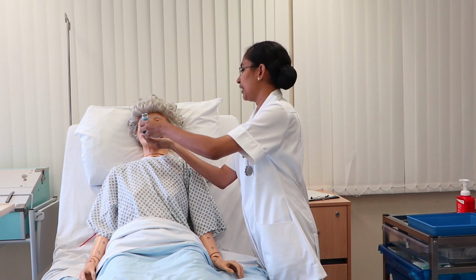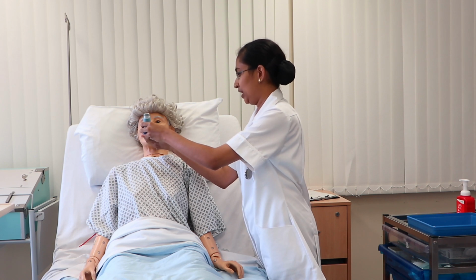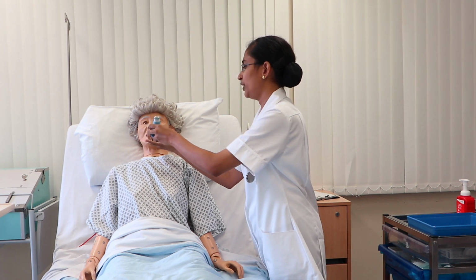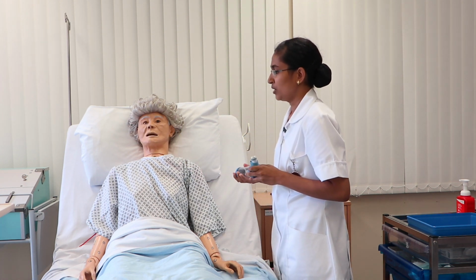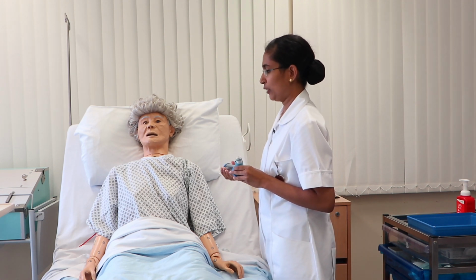Okay, can we have 5 cycles of respiration? Inhale, exhale. 1, 2, 3, 4, 5. I am going to remove it, and you can exhale through pursed lips. Is that all right for you? Okay, so I have to give you 2 puffs. So can I go with the second puff?